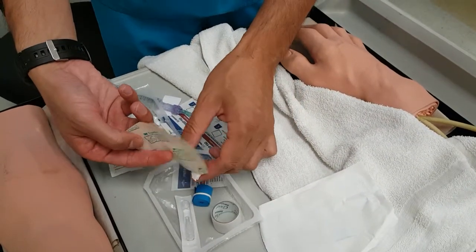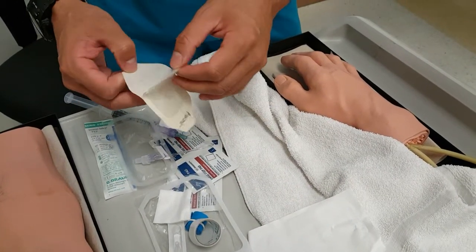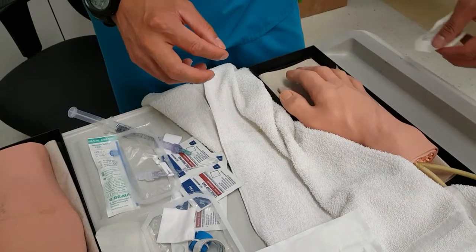My tape — I've got a Tegaderm here and I've got tape. I'll show you how to use it if you don't have a Tegaderm, so you know how to do it both ways. I'll just leave it on the side.